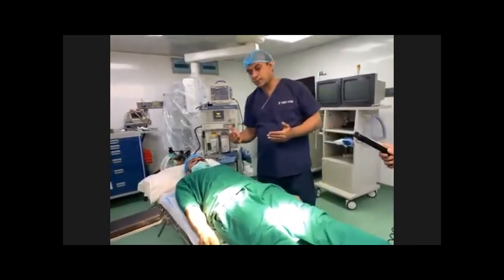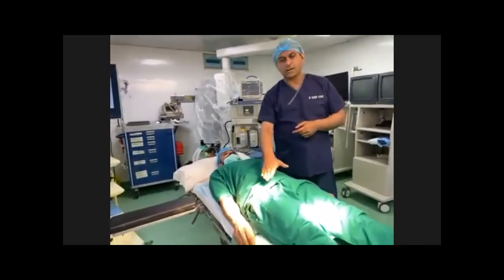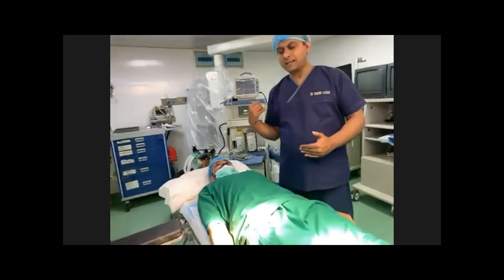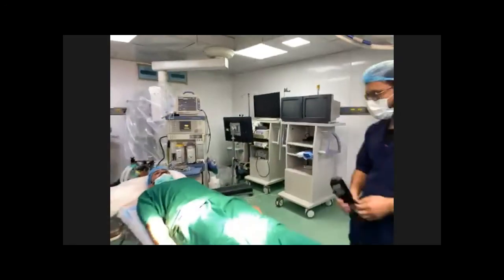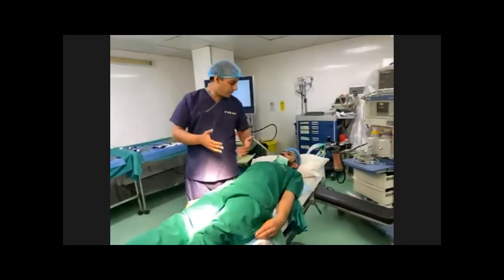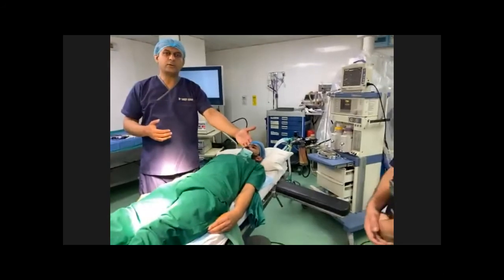Another important procedure is laparoscopic inguinal hernia. If you are performing a right inguinal hernia repair, the surgeon should stand on the left side of the patient, and you put the three ports in, and your assistant, holding the camera, will be on your right side. The second assistant will be on the right of the patient. And if you are performing a left hernia repair laparoscopically, then you have to be on the right side of the patient. Then the cameraman will be holding the camera on your left side, and the other assistant will be on the left of the patient.